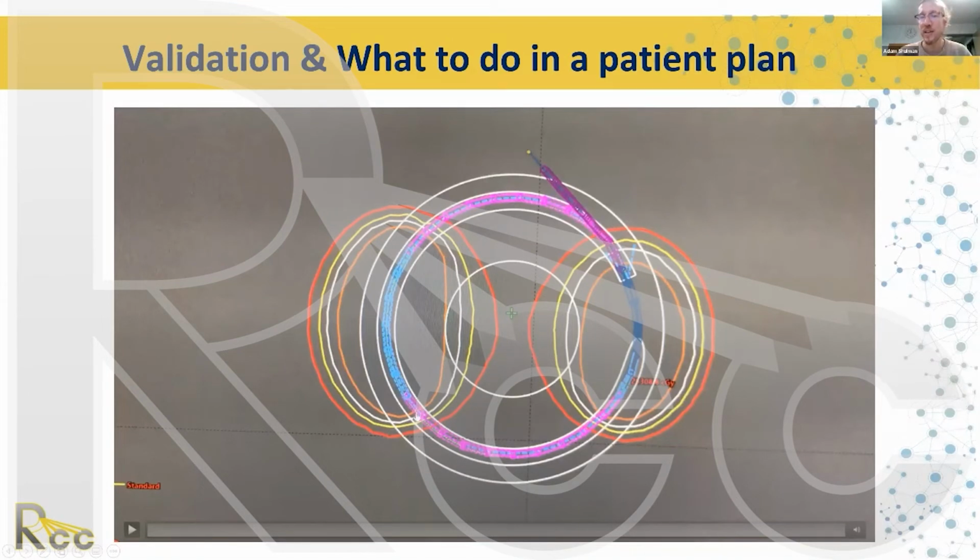So a 1265 dwell position would actually deliver in the patient where this TPS dwell position is. So for example, in the Varian Gammamed system in Brachyvision, you can just quickly type in a 5mm offset and it will shift all of these dwell positions 5mm further back. So the actual listed dwell positions would be 5mm different than your dosimetry dwell positions.